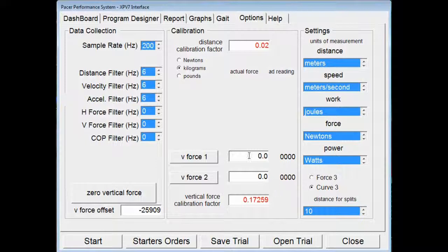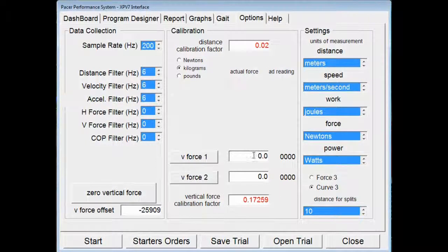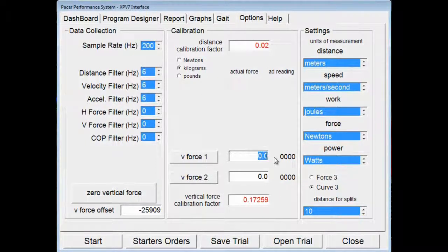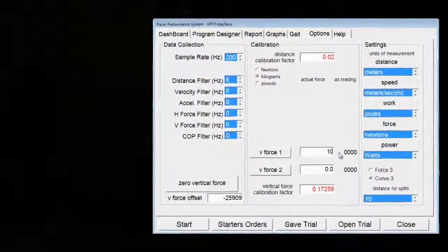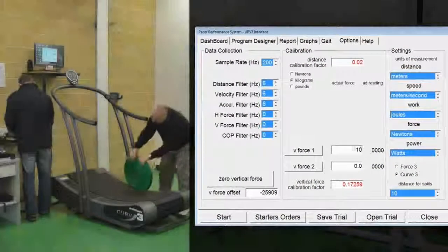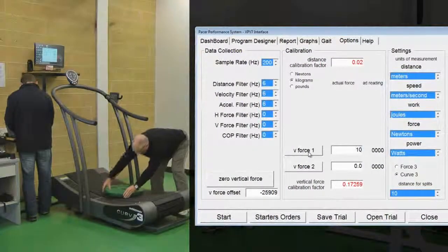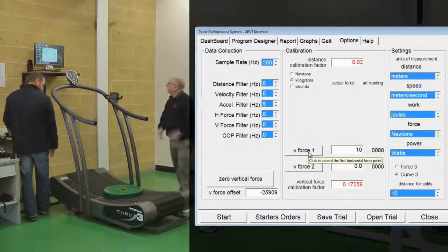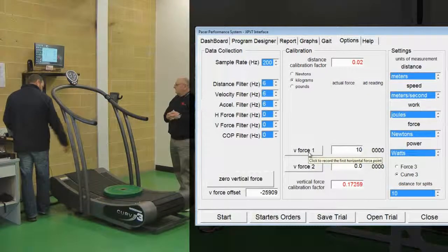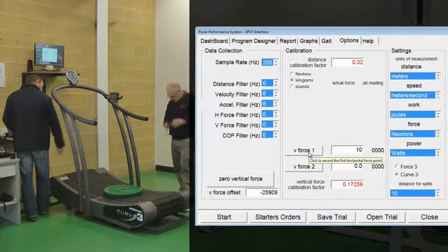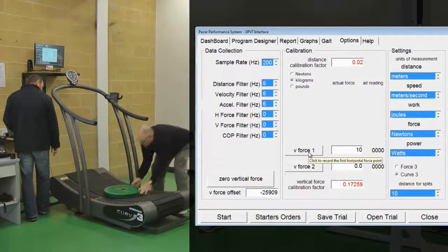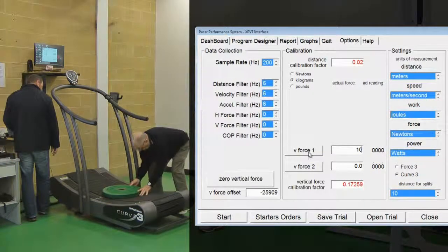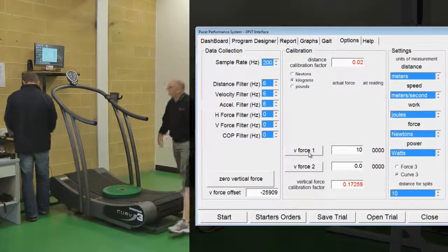In this case we are going to use kilograms, so we click on kilograms. We are going to apply a known mass to the force plate as vertical force 1. In this case 10 kilograms. We put that on the treadmill, click the V-Force 1 button.